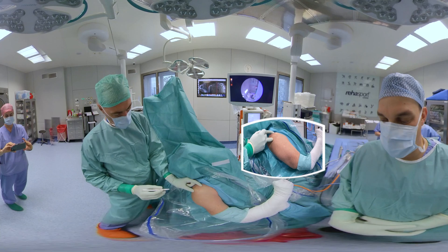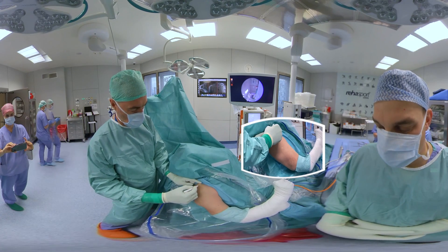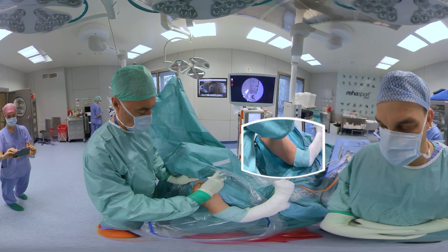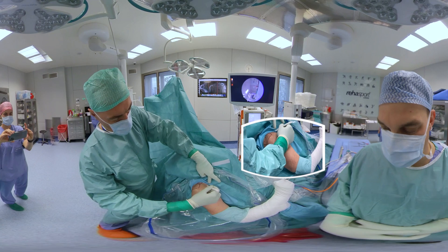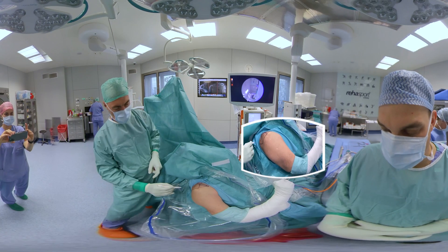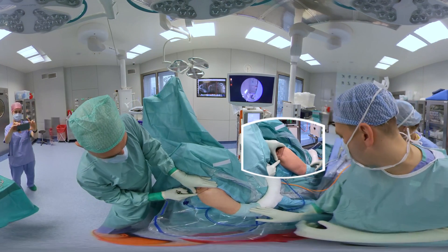MRI of the shoulder shows full-thickness complete supraspinatus tear with signs of tendon degeneration, but no retraction and no atrophy of the muscle. The patient is under general anesthesia combined with brachial plexus block. We typically place the patient in the beach-chair position, and an arm holder is used to position the arm throughout the procedure. Anatomical landmarks are drawn on the skin, then the arthroscope is inserted via a standard portal.